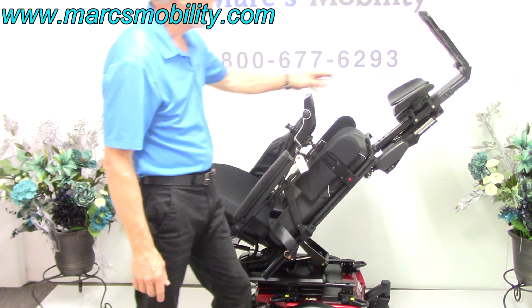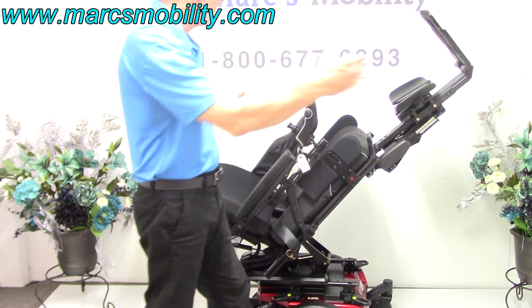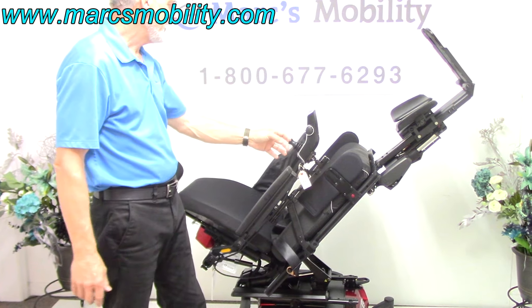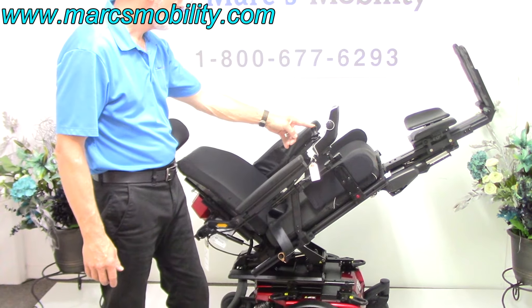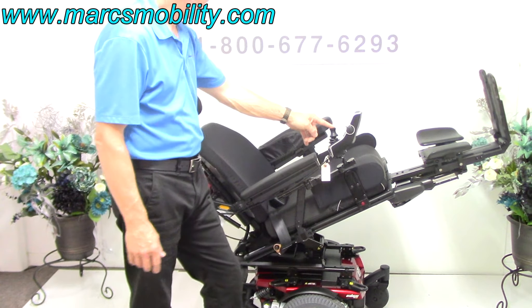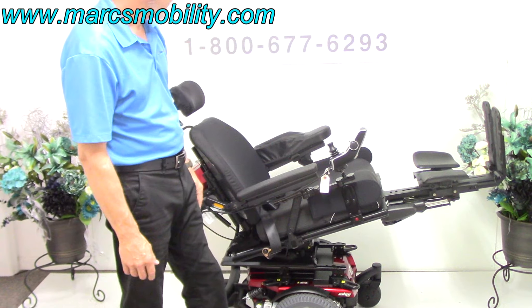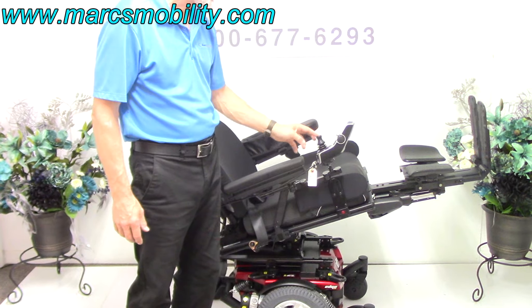These legs are also adjustable — whether you're five feet or six foot two, we can adjust the length. For circulation, this position is a bit extreme. You can actually do it from a less tilted position, and you'll still get the circulation benefit.